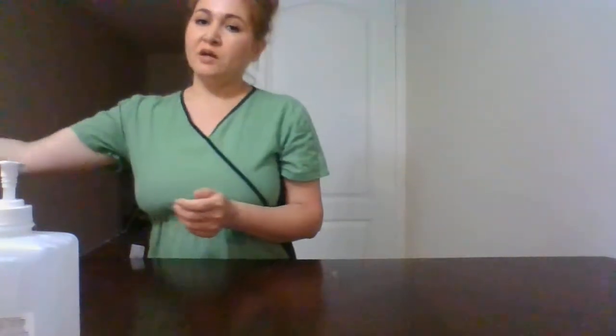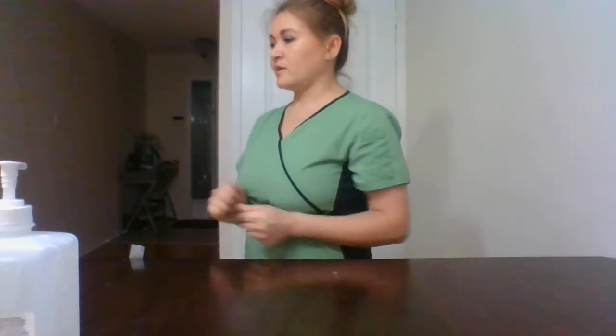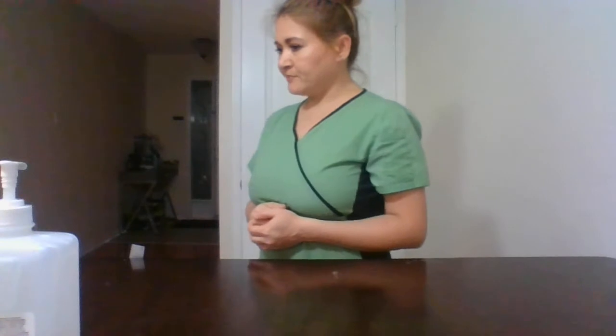Okay, we always have to maintain the privacy of the patient. So the first thing I would do is close the curtain. Good morning, Mrs. Jones. My name is Camila. I am here because the physician has ordered a catheter to drain your urine. Is that okay with you? Okay, great. How are you feeling today?